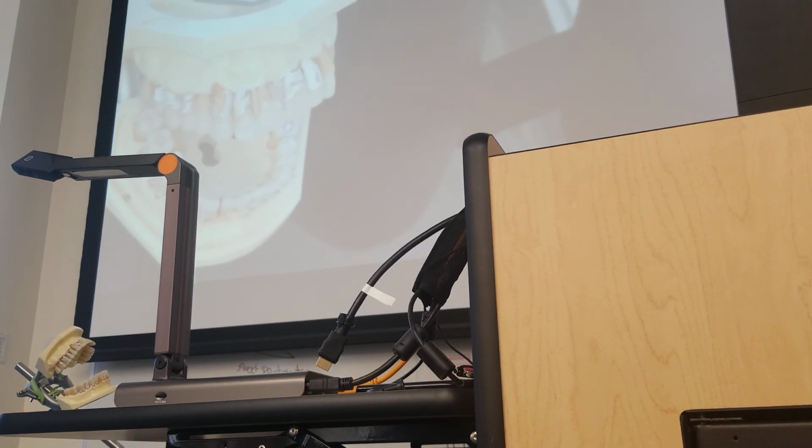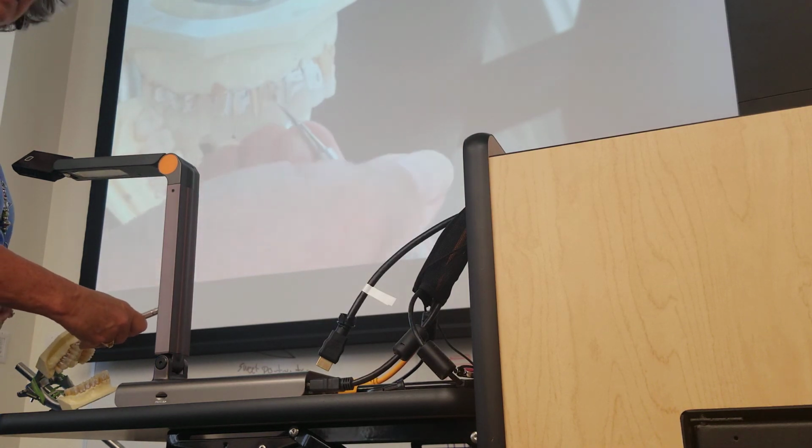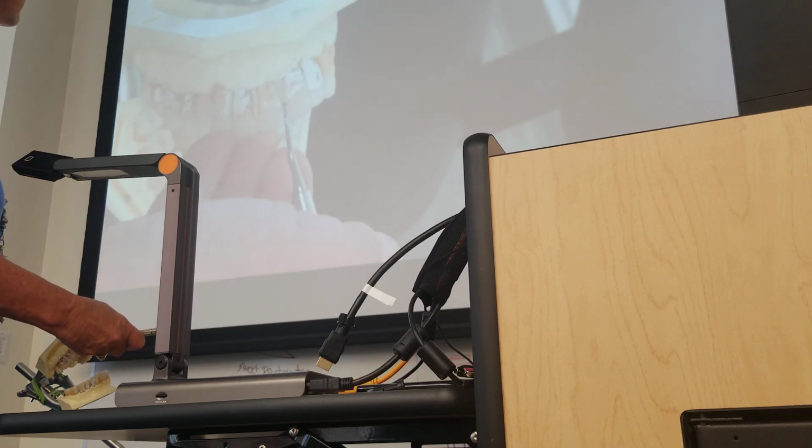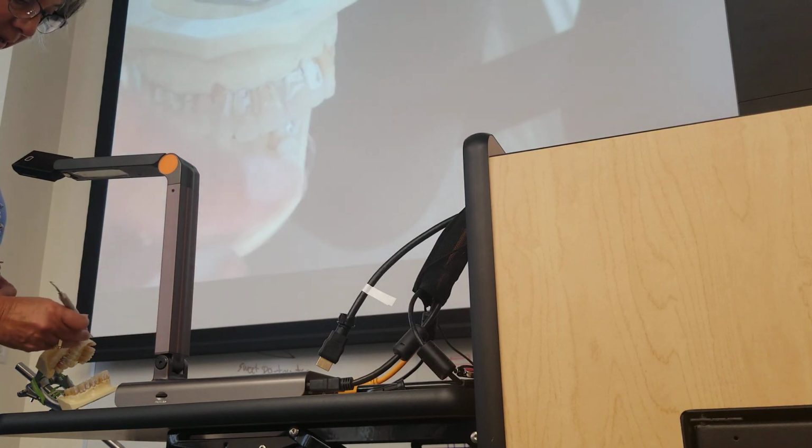Yeah. Yes, if you're doing surfaces away, like that, and then you've done all your surfaces away, now you're going to do the horizontal stroke. You're going to have to flip it to keep that outer edge.